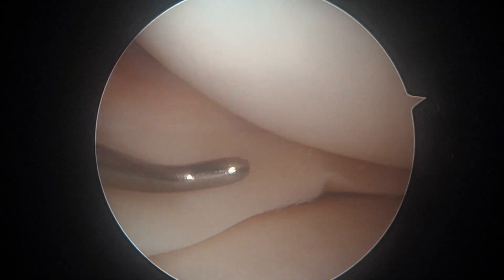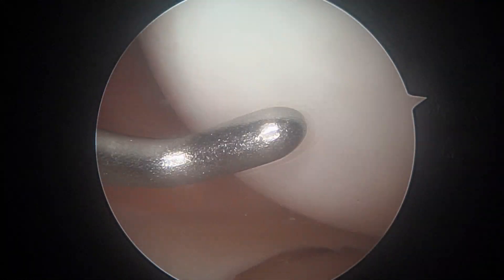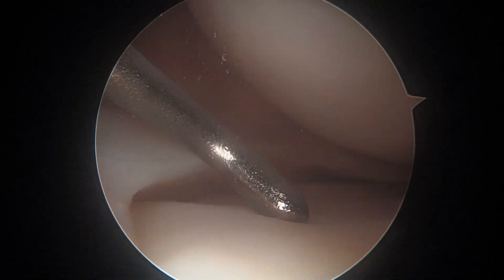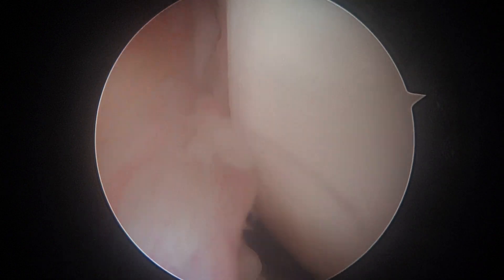I'm looking at it again — okay, I'm happy with that. We'll keep looking, but I don't think there's anything to do in this medial compartment. The articular surface above looks good, the tibial plateau looks pretty good. And so now, as we slide over here, we're going to get our first look at this torn ACL.